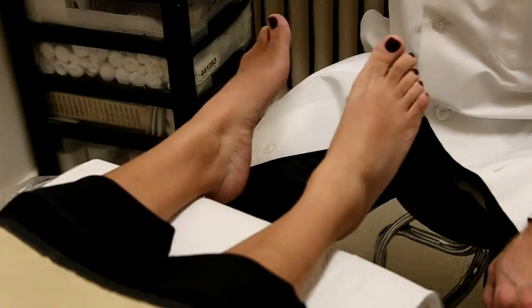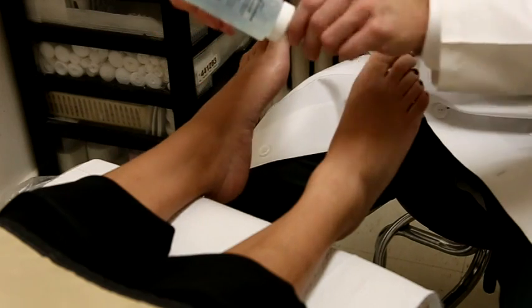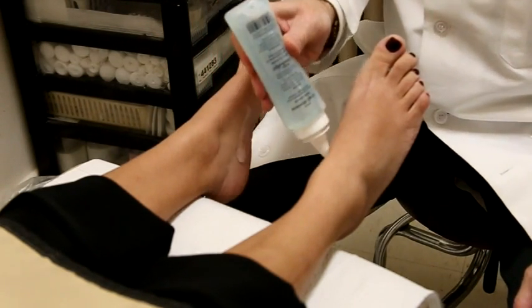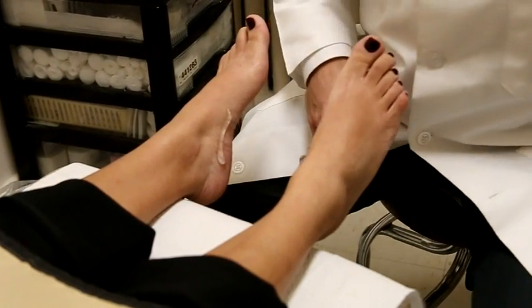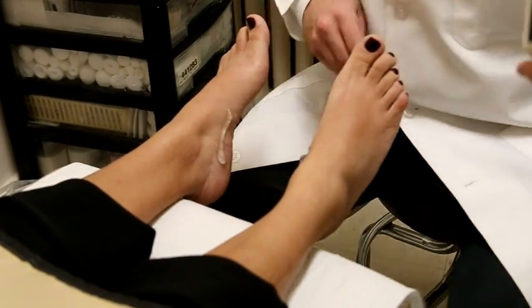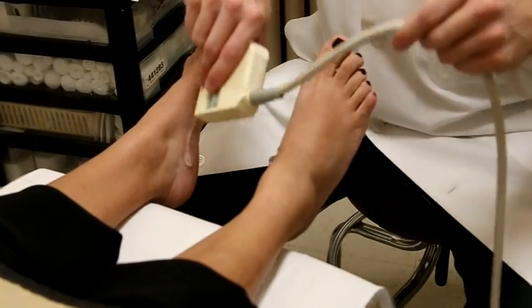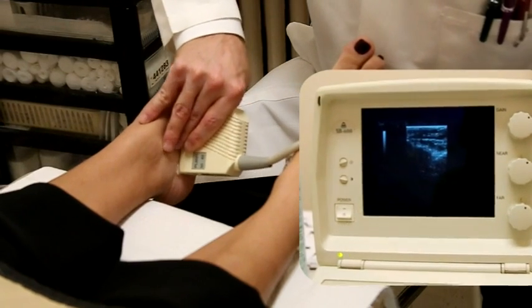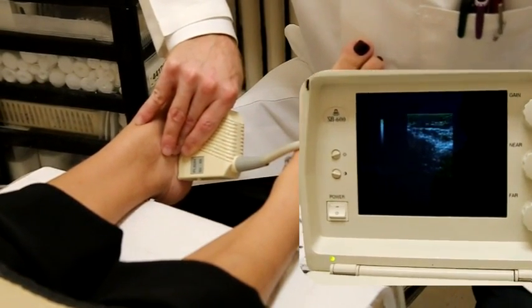Okay, so now we're going to perform our ultrasonic diagnostic examinations of both feet, and we typically look at the plantar fascial ligament, which is the bridge between the heel and the toes. It takes a lot of impact, and many individuals have concerns with this part of the foot. Okay, so here we have the plantar fascial ligament image, and it appears to be a normal image for us here on the screen.